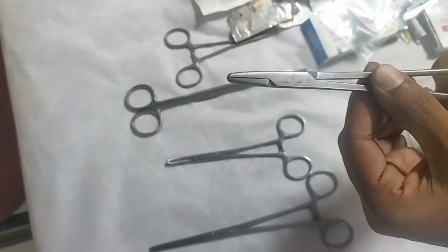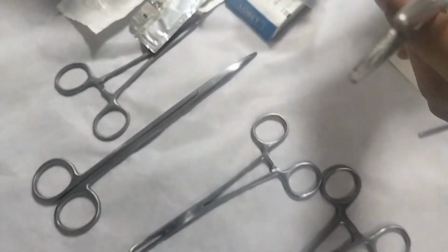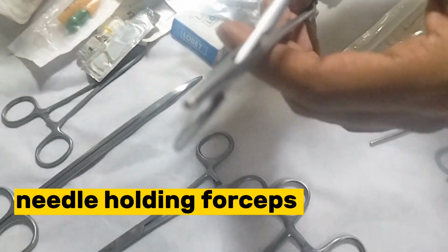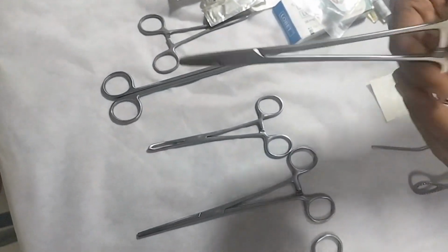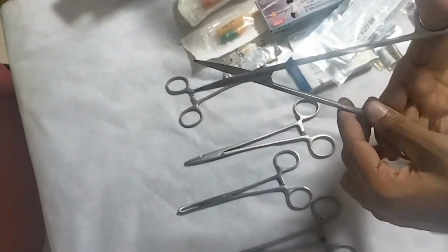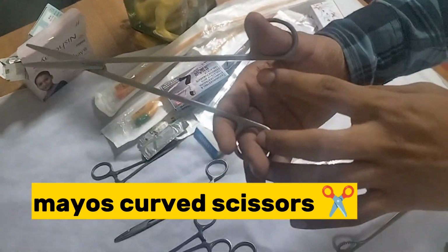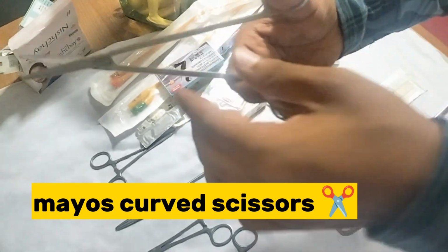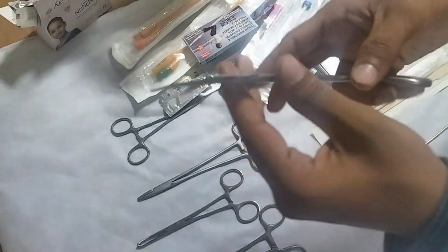Next. Again, this is a needle holding forceps only. Same thing. It has a small groove used to hold the needle at the anterior 2/3 and the posterior 1/3. Okay, it has a better grip and is used for suturing purposes. Next. Here we got curved scissor, Mayo scissor, and you can see there is no locking mechanism in the proximal part. Long shaft and blades you can see. These are curved sharp blades.